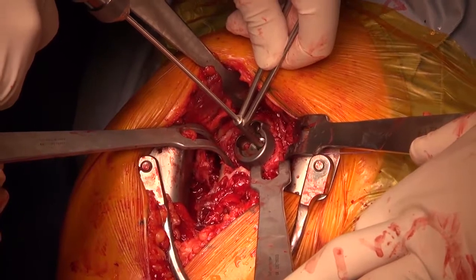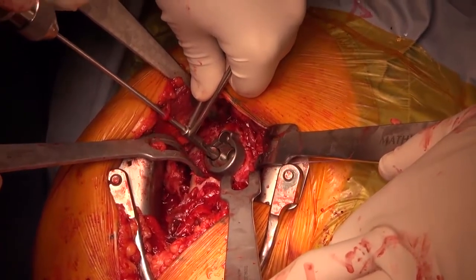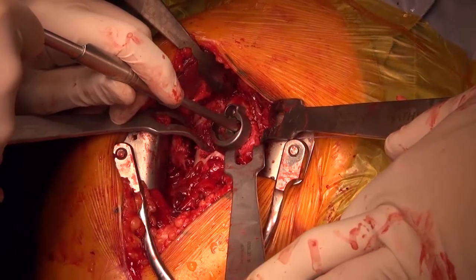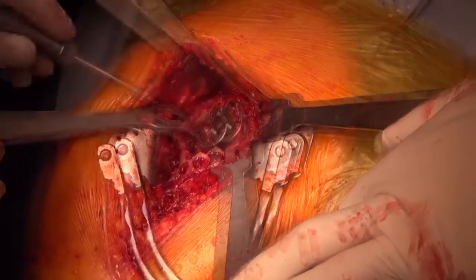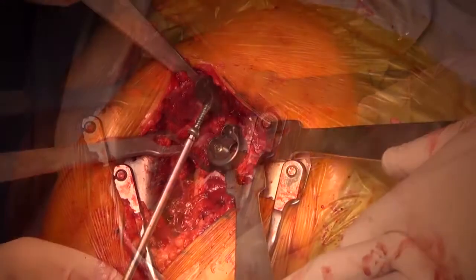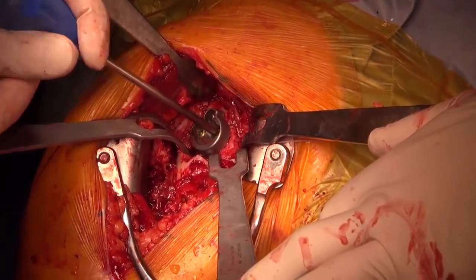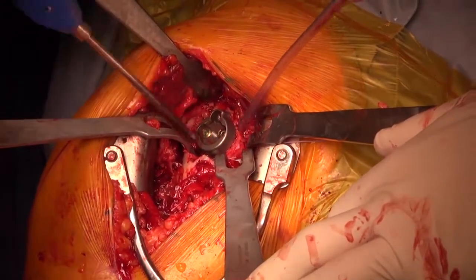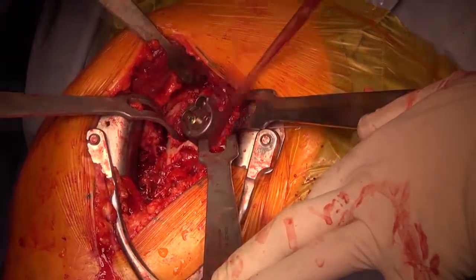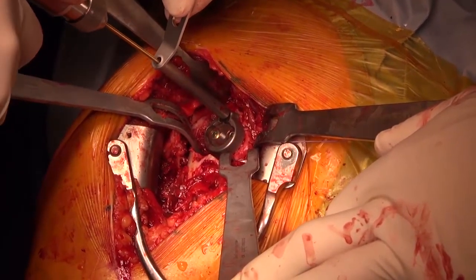Slightly convergent holes are drilled to accept cortical bone screws. The depth of the holes is measured and the screws are inserted. The screws are tightened alternately. A variable angle locking screw is placed in the direction of the coracoid base.